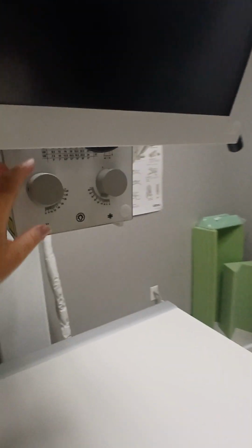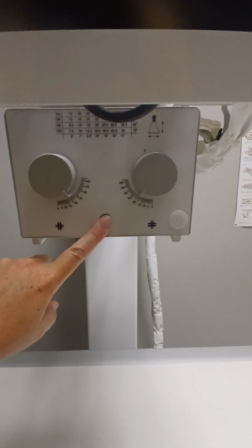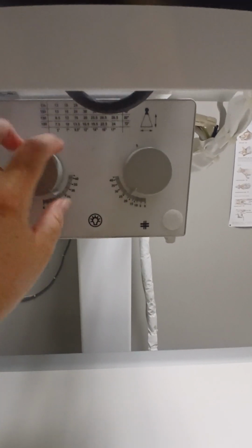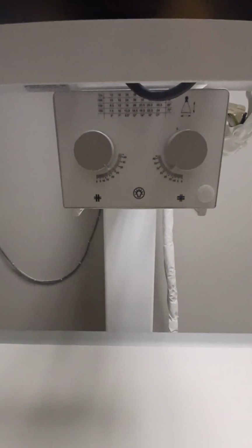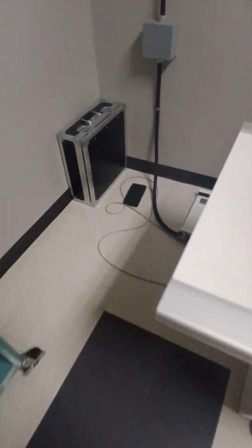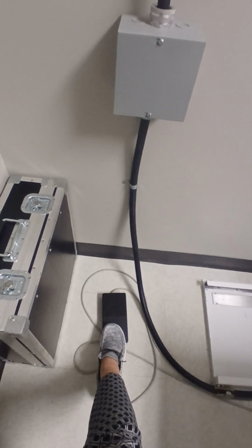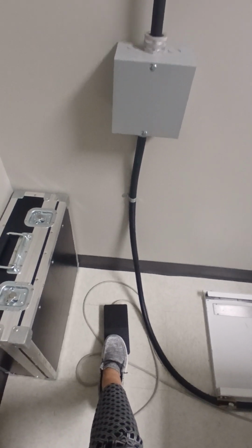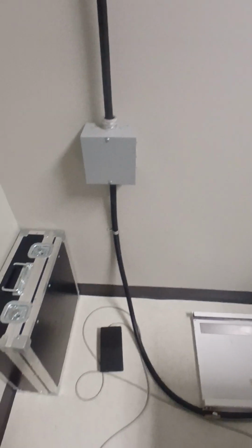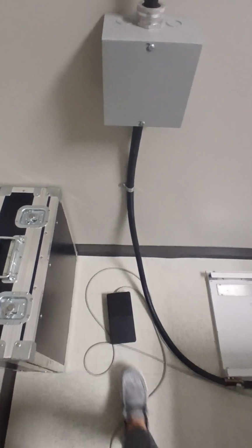So here we have control buttons for our collimation. So we'll turn this light on and we can actually adjust the collimation beam for the x-ray. The other thing we have here is the dead man switch. So this is a two-step switch. When we push it first, what's going to happen on the first step is that the rotating anode is going to go ahead and get started. And then we continue to press more firmly on it, and that's going to actually snap the x-ray.